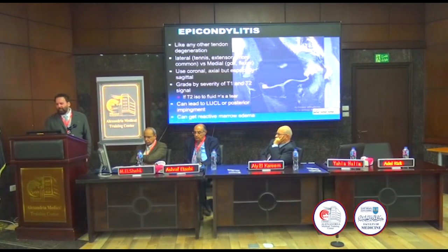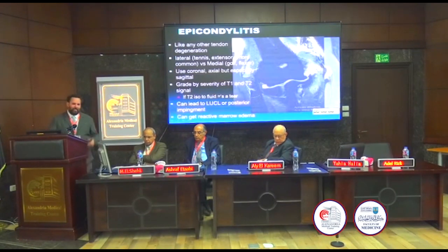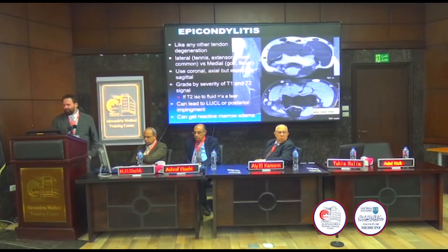Someone here has fluid involving all the tendons, with a little bit of retraction, right? If this is a shoulder, we would call this a large rotator cuff tear with a small amount of retraction. And this would be a medial tendon tear with a lot of retraction, versus a small amount of retraction.